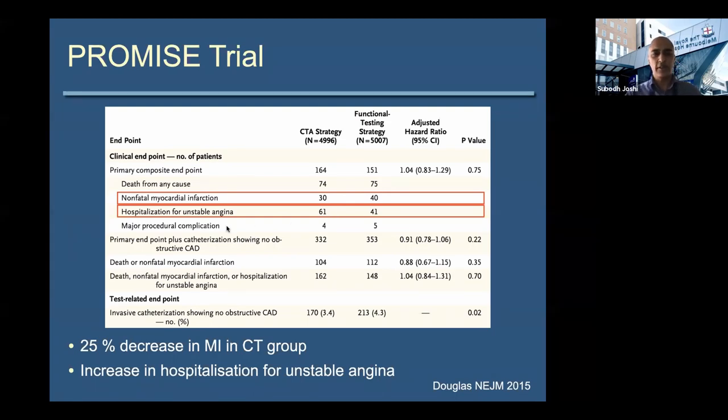Now, within the troponin era, I'm not exactly sure what this is, but what I just hypothesize is that perhaps these are patients with chest pain that may not have even been ischemic, but for which they present to hospital and they get admitted because they have plaque on a CT. And I think this is a very real phenomenon in that cardiac CT does actually pick up incidental coronary artery disease that might not be the cause of the symptoms. And I think that's going to be one of the big callings for functional testing.